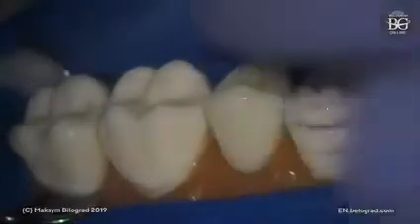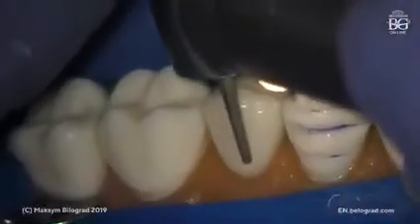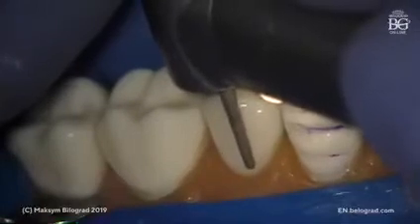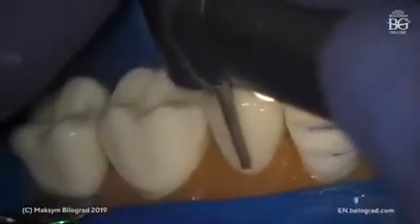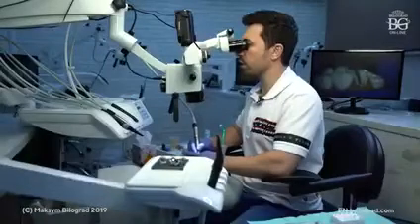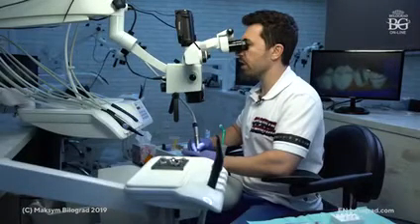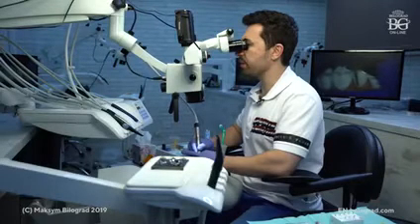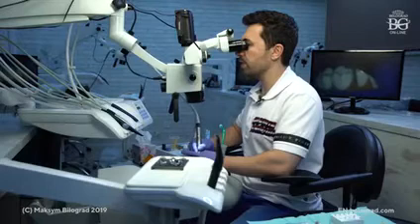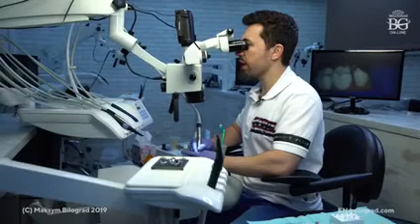So keep your burr parallel to the cervical area, not to the long axis of the tooth. We are doing the initial finish line using less than half of the tip, just making a scratch.